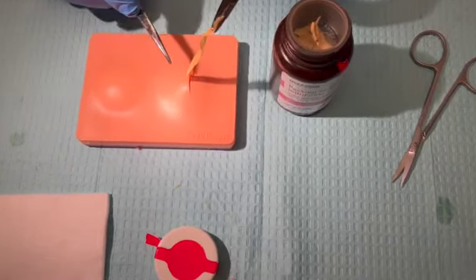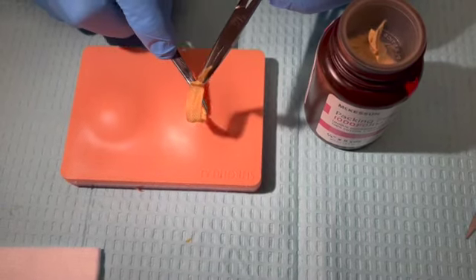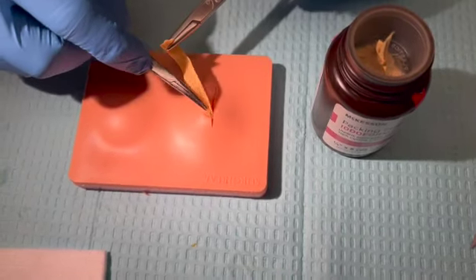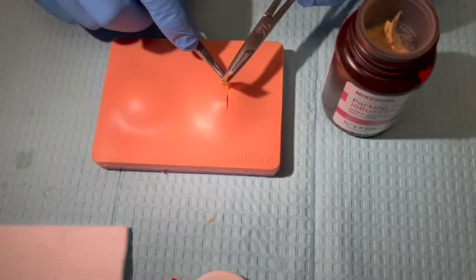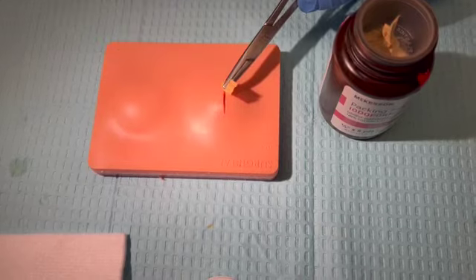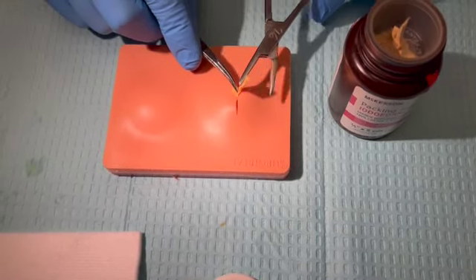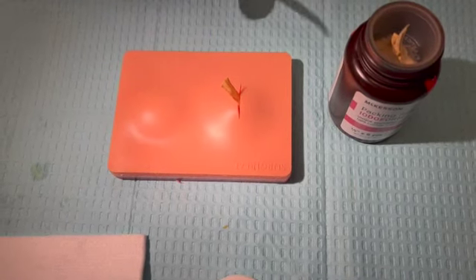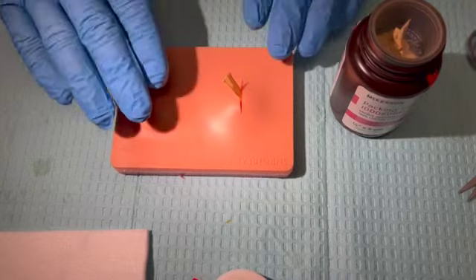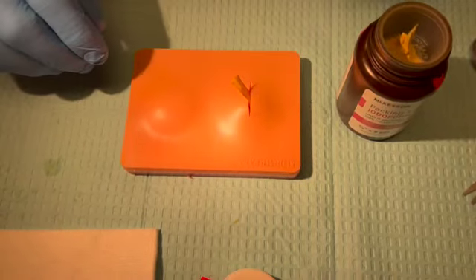We're going to insert this, and we could use our curved hemostats, or we could use the opposite end of a cotton-tipped applicator, and we're just going to fill that region enough that this will not come off. We'll release our grip on that packing. Release. We're going to leave, again, approximately 1 centimeter hanging out. This will prevent the wound from closing, and it serves as a wick for continued drainage.